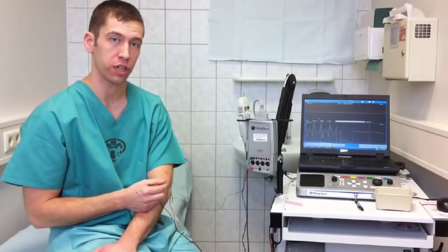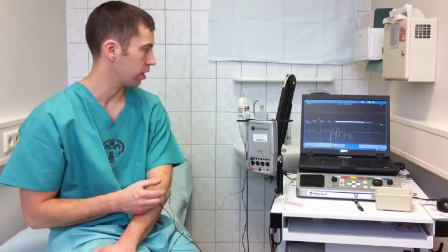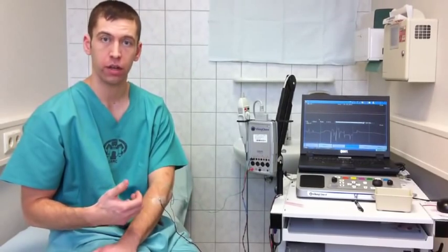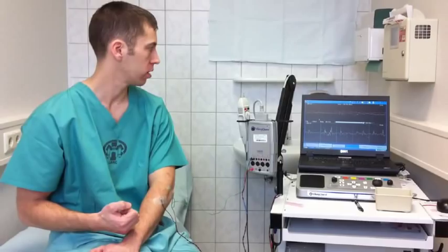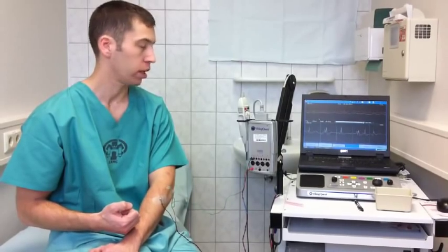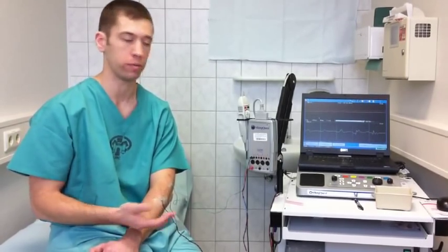During the first part of this, the needle is gently inserted and the impulses are analyzed for spontaneous activity. During the second part of the needle EMG test, the EMG physician will analyze the impulses that your muscles generate. This can be a sign of a muscle or nerve disorder if the impulses are abnormal.